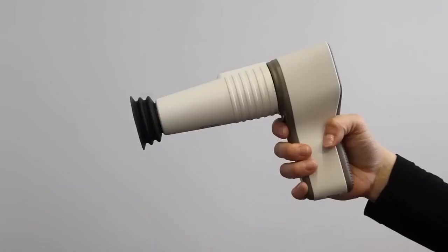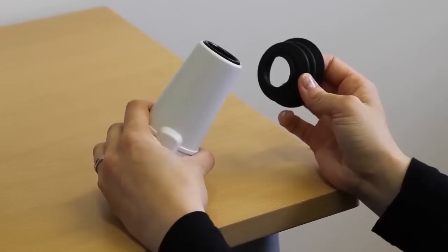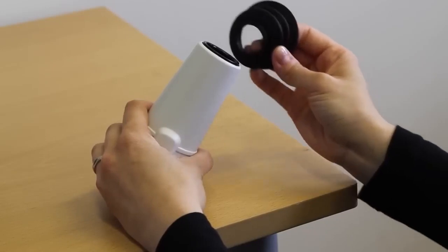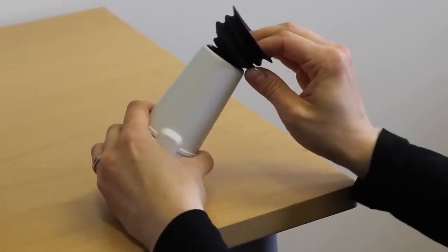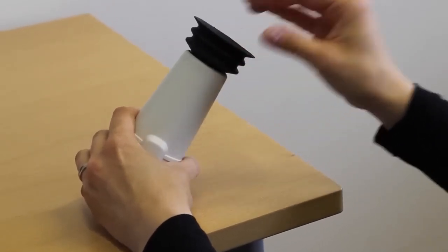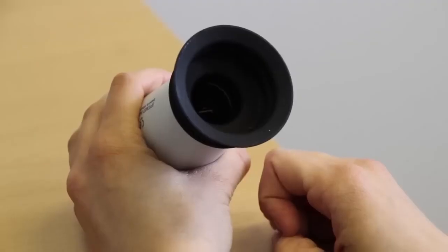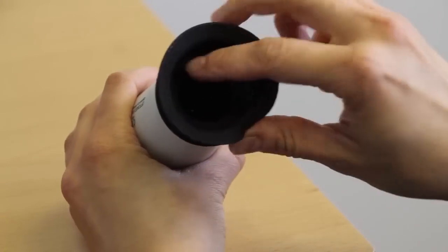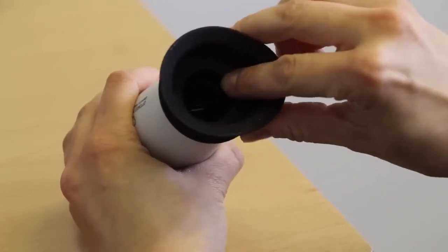The retinal module can be used with an optional silicone eye cup to give additional stability and comfort to the patient, as well as acting as a light shield. Attach the silicone eye cup by pressing its base into the Optics module.